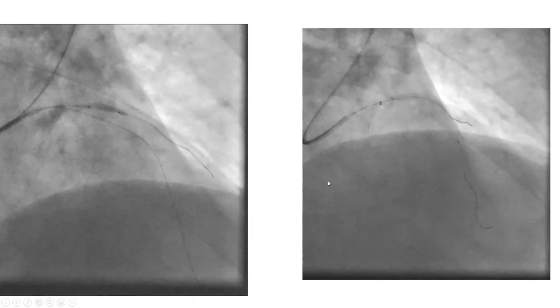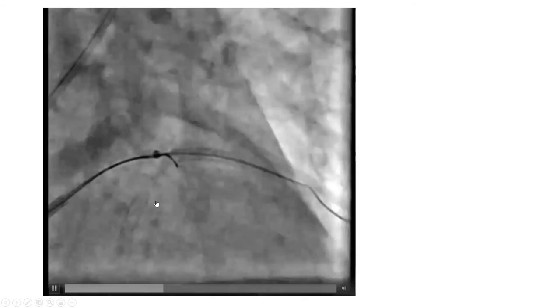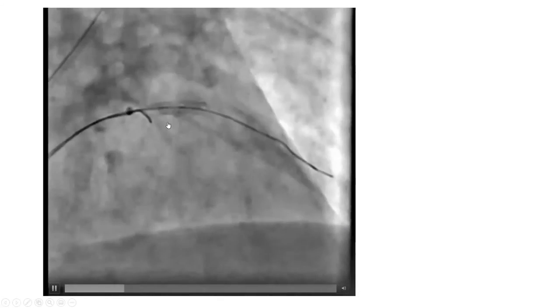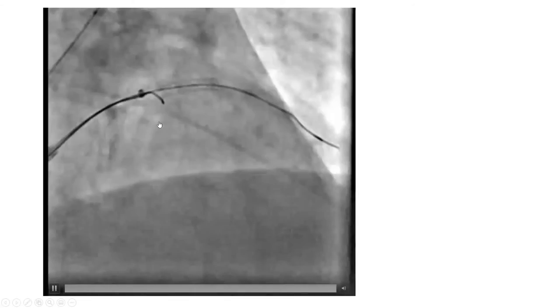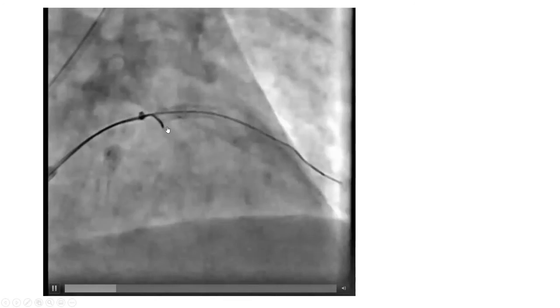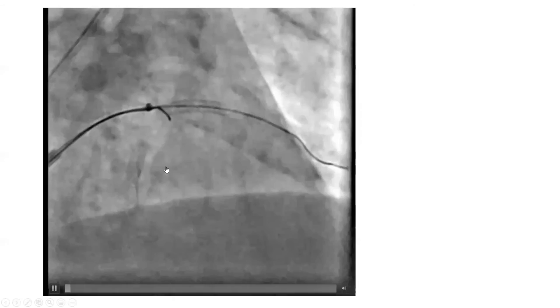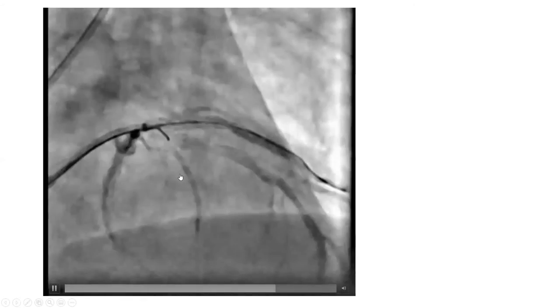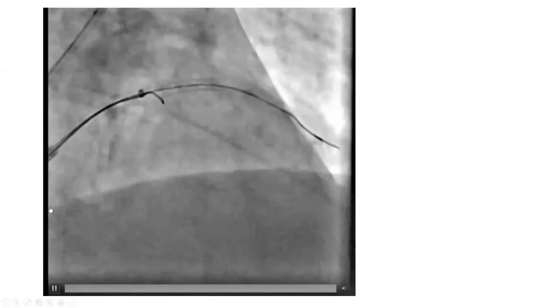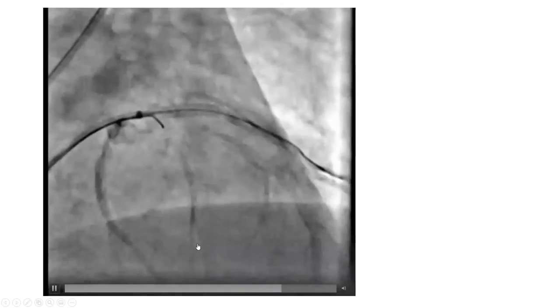We started to think: what is the problem, in order to deal with it? One issue we thought was that maybe we're going through a stent cell that has a lot of fibrosis — maybe that stent is extending into the LAD. So we tried rewiring multiple times, trying to go through different stent cells using different wire shapes. We used BMW wire, Samurai RC, ProWater, and multiple workhorse wires. But again, the same issue — we could not advance any balloon.